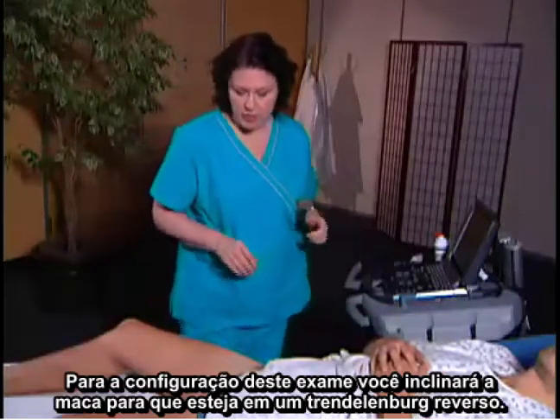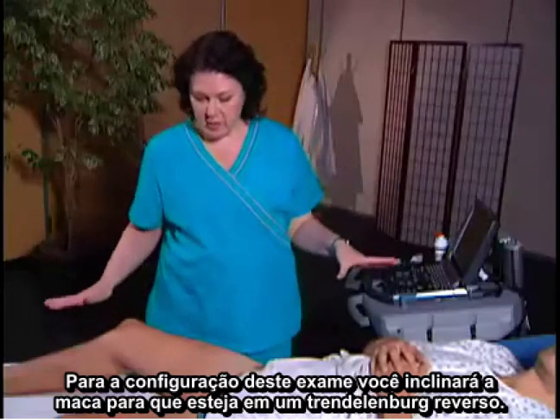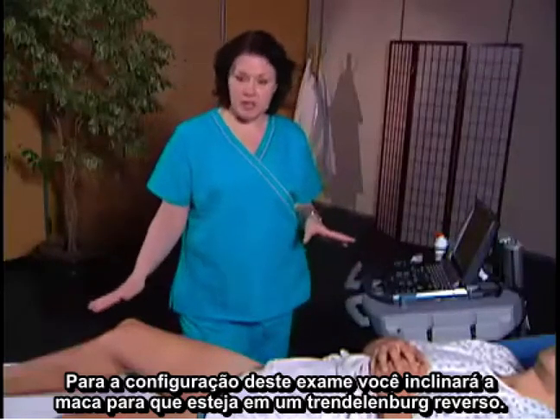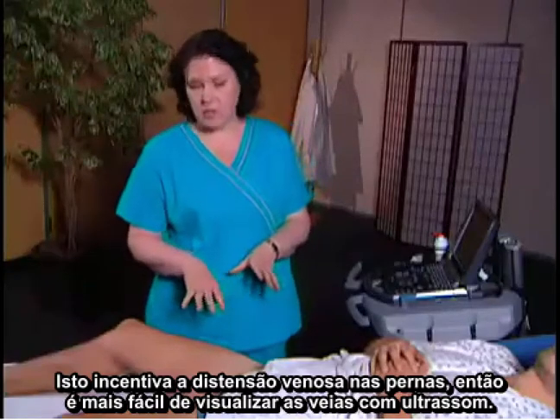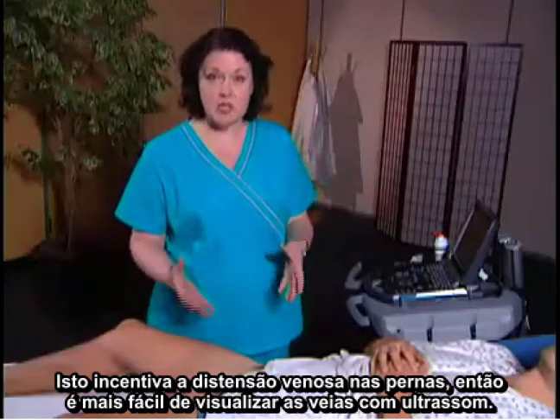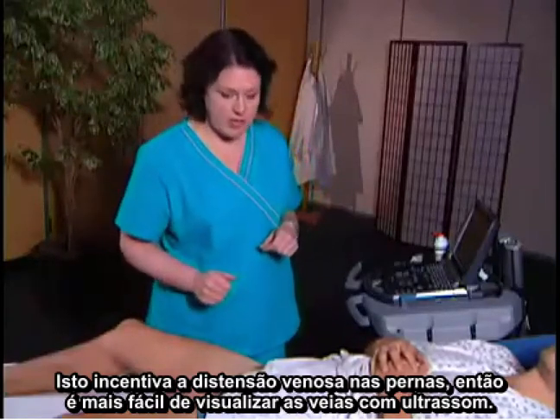To set up for this examination, you want to tilt the gurney so that you're in a reverse Trendelenburg. This encourages venous distension in the leg, so it's easier to visualize the veins with ultrasound.